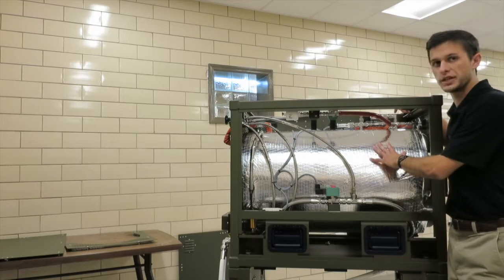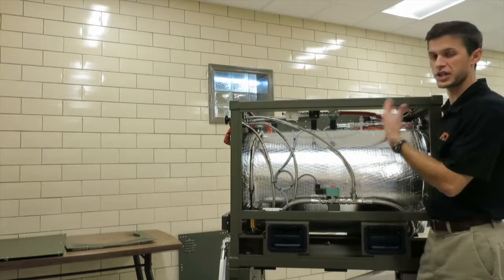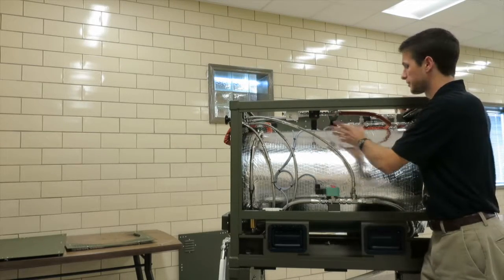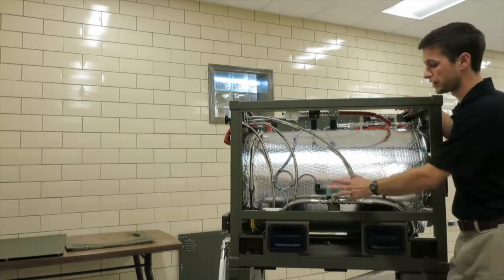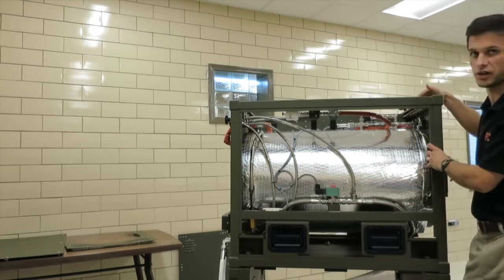Today we're talking about the P2131 sterilizer, and what we're going to do is walk around the sterilizer with all the panels off and talk about each component. What does the component do? Why is it there? What does it do for the performance of the sterilizer?